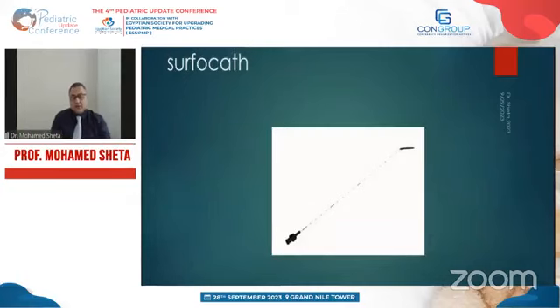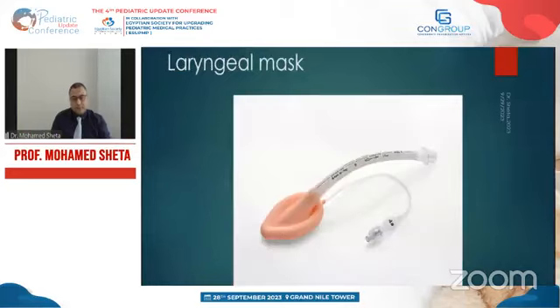So this is a Surfcath. This is the catheter which we can use to give the surfactant by the LISA technique, and it's very easy and simple to give, as we will see in the videos. So the babies who are on nasal CPAP, who are breathing spontaneously but have respiratory distress syndrome, severely distressed, either extreme preterm or premature, and they need surfactant, we can give them by the LISA technique with this Surfcath.